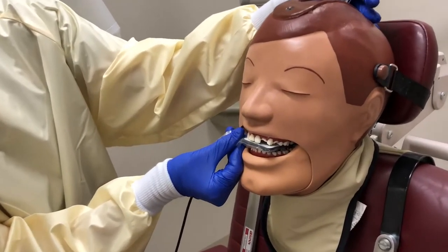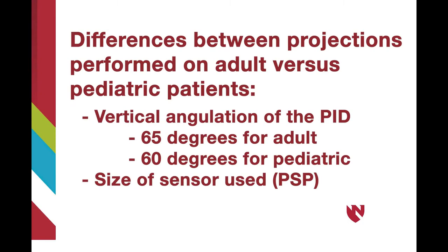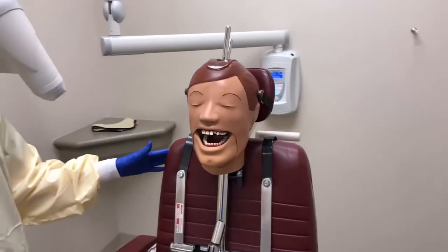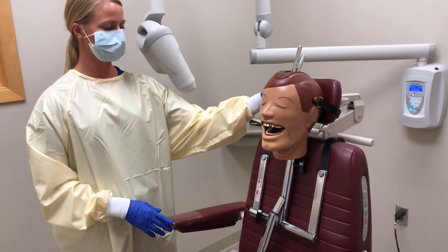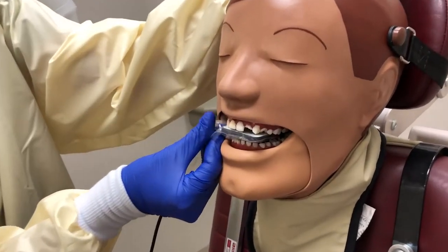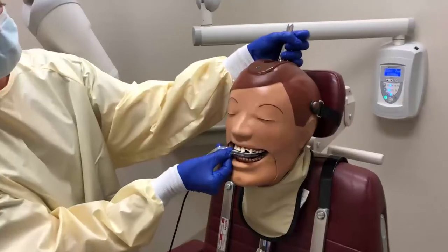With occlusal radiographs, the sensor does not touch the floor of the mouth or the palate, making it easier for the child to tolerate. The main difference between a maxillary topographic occlusal projection and a maxillary pediatric occlusal projection is the vertical angulation of the position-indicating device to the plane of the sensor, as well as the size of the sensor used. A size 2 sensor remains the same; the size differs only when using phosphor plates or films. Begin by having the child sit upright and comfortable in the dental chair, positioning the maxillary arch parallel to the floor. Use a size 2 sensor and place it into the child's mouth with the tube side facing the maxilla. Instruct the patient to lightly bite on the sensor, just enough to hold it in place.